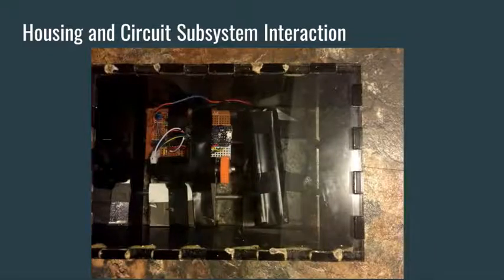So we have our biocompatible shield, which protects the circuit subsystem and the expander from any outside particles such as food or saliva. We have the electrical tape that is holding the circuit subsystem in place on top of the expander. This is to ensure that nothing interferes with the meshing of the two gears, and also to ensure that the meshing of the two gears is continual as the expander widens, so that it will always widen on time, and always widen that 1/4 millimeter turn when it needs to.